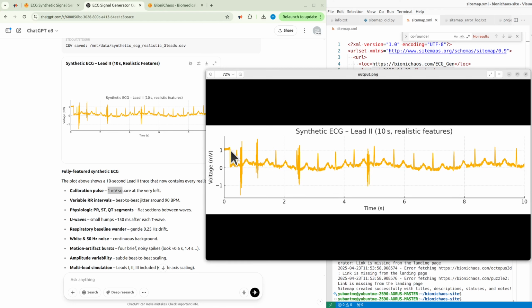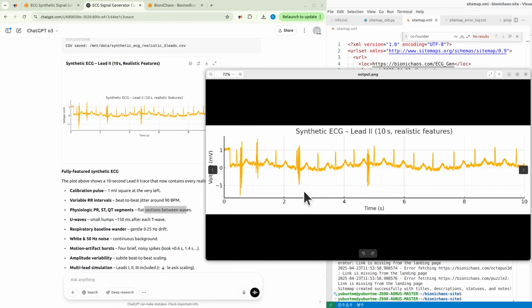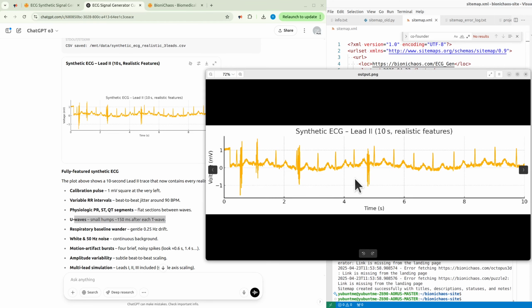It's just trying to make it hyper realistic, as if you're actually recording it in a clinical environment. Yep, variable RR intervals, physiologic PR, ST, QT segments, flat section between them. Yeah, we got that. What else? U waves, small humps, 150 milliseconds after each T wave. Okay. Can't actually see it. Wait. Somewhere there.